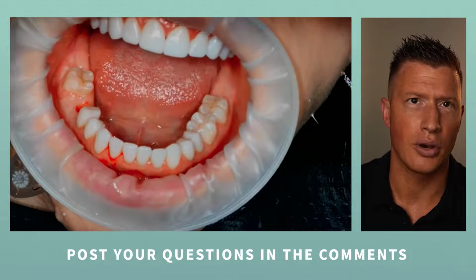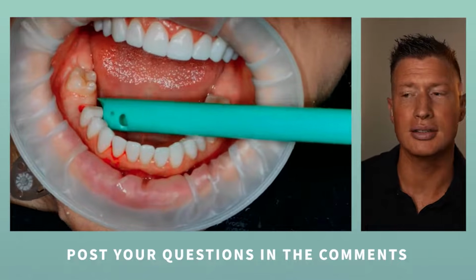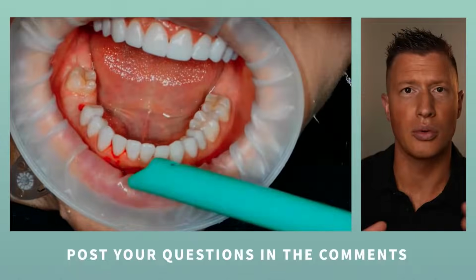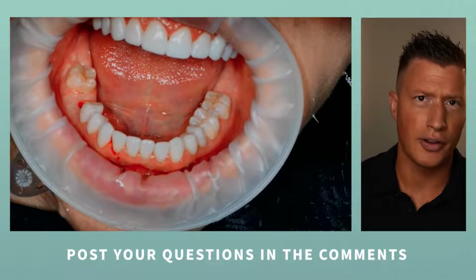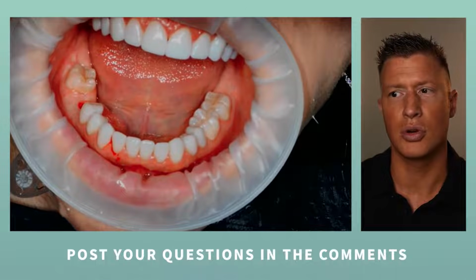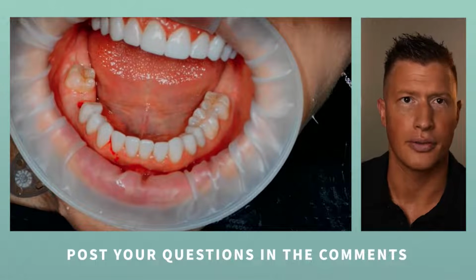Profiling is a way... I don't know if some of you watching this are thinking, this is different than the implant that I've already gotten, or you may already have implants and struggle with food impaction or issues with that. This profiler allows us to shape the gum tissue in a way that is optimal for the healing process and then for your future crown.